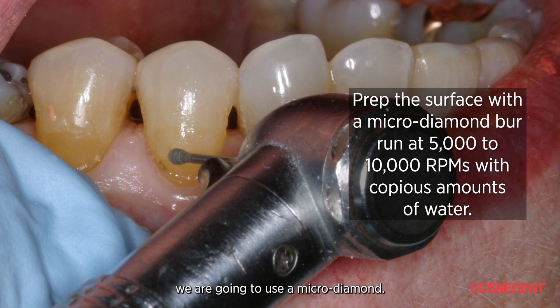We're going to prep it using a microdiamond. Microdiamonds are great because they have great access — they're small diamonds and they can get you anywhere you want without creating a problem. Down in this particular instance, you've got sclerotic dentin and biofilm. How do I get rid of it? Not with a prophy cup, because I don't want to irritate the gingival, and the gingival health of this person is impeccable — why would I touch it?